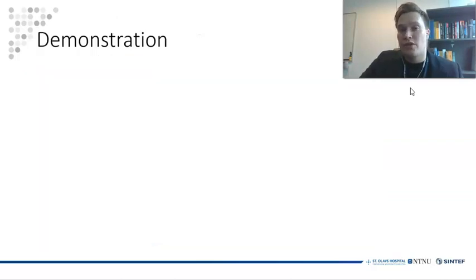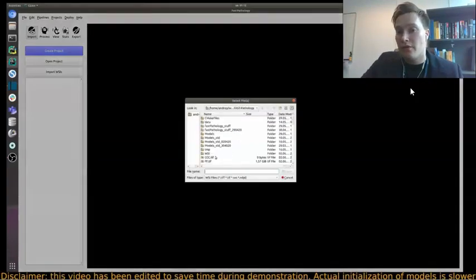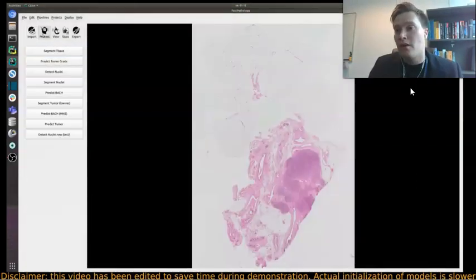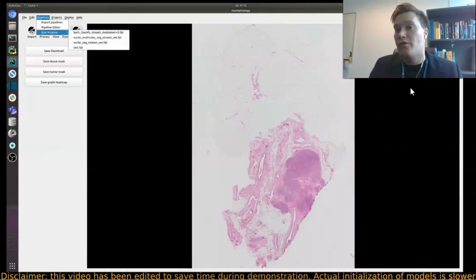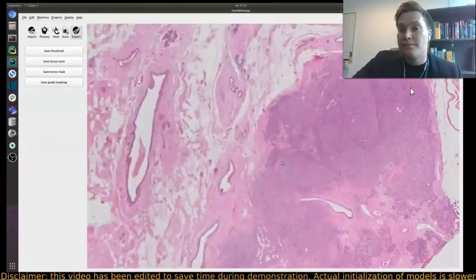And now I'm just going to show you a very little demonstration. In this demo, you can see me choosing some hosted image. On the left, you can see what the GUI looks like. You have different options for handling processing and rendering. You also have options for running pipelines and editing them yourself, creating and opening projects, etc.